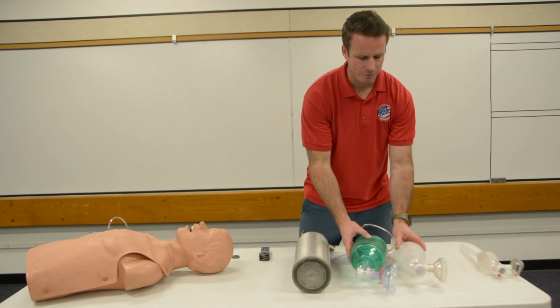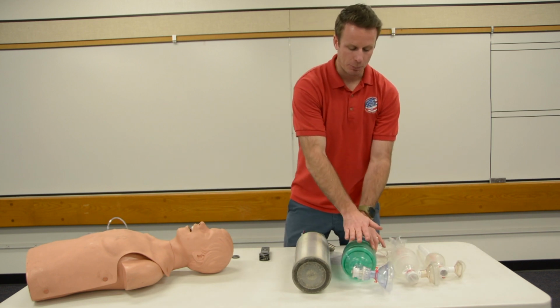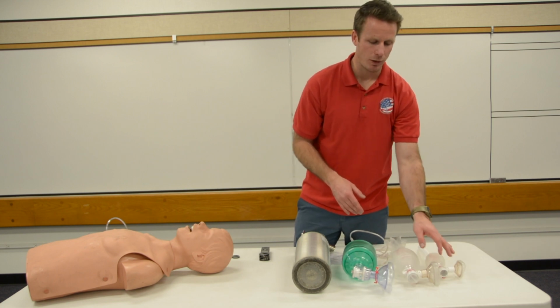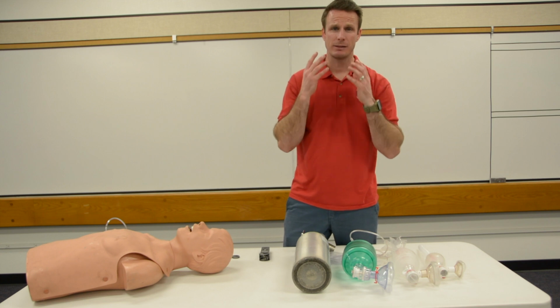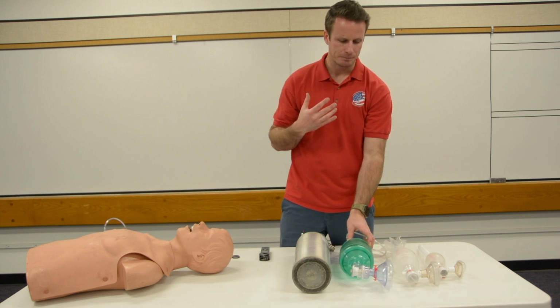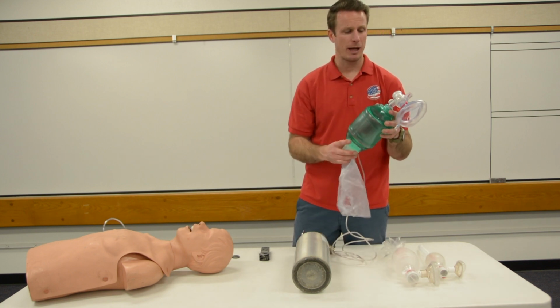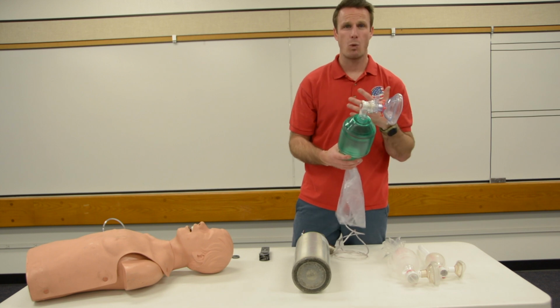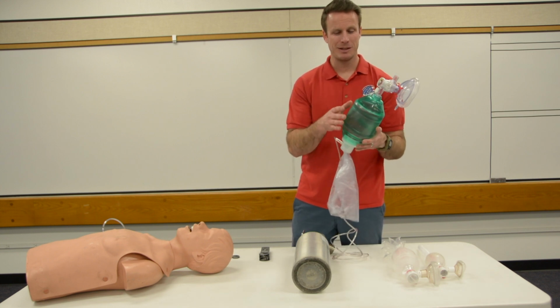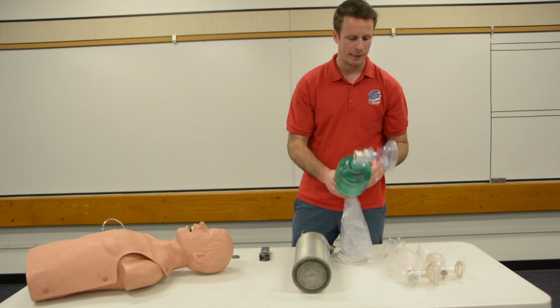Now, our bag valve masks come in a couple different sizes, so you want to make sure that you select the appropriate size for your patient. And then you want the appropriate mask as well. Some of these masks come in different sizes, and we want to make sure that we have a good seal around the patient's nose and mouth area. This is your adult BVM. These adult BVMs can be pretty large and can deliver quite a bit of breath to your patient. Now, the thing we need to know is the patient really only needs about half of this bag. You don't need to squeeze the entire bag into the patient's lungs.